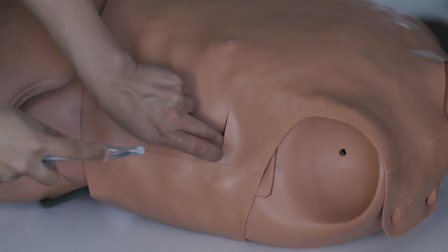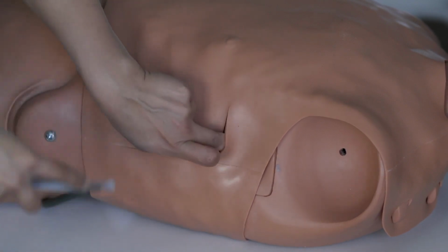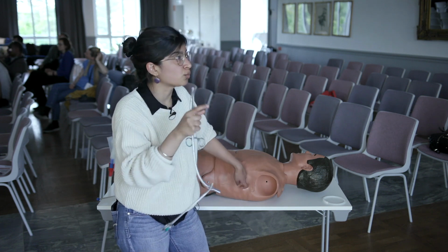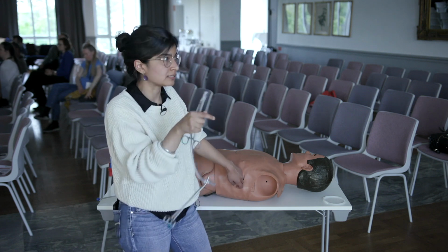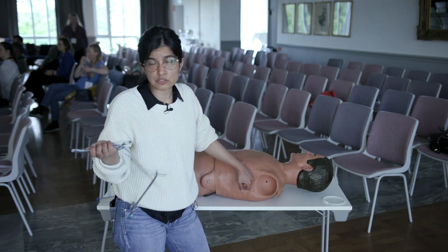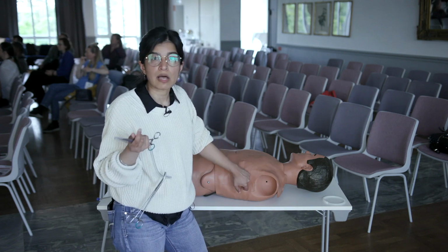Now you take your preloaded drain, and then again, oh sorry, one thing I forgot to mention. Once your finger is in, you want to sort of move your finger around. You want to feel that the lung has re-expanded and you can actually touch it. It's in your field. You want to feel for any adhesions that may be present. Maybe this guy had a prior chest drain, right? You want to take those adhesions down with your finger, and they tend to be pretty pliable.